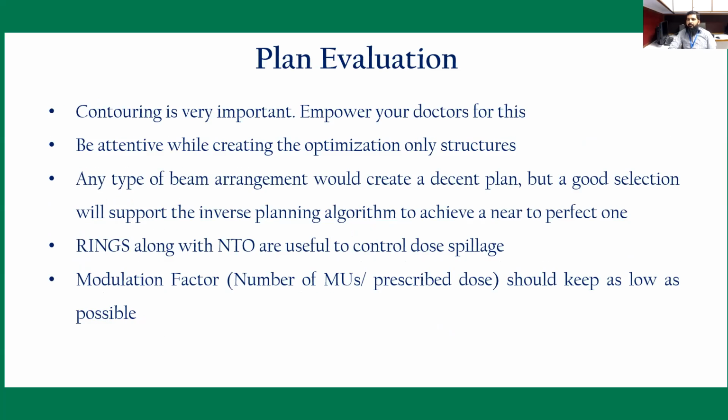Again, contouring is very important for that. For this, we have to empower your doctors regarding the contouring, so that they do their part perfectly. When you are optimizing, you are making structures, the OARs plus margins, so you have to be attentive while creating them. If you are selecting any type of arc plan, it will make a very decent plan. But for the inverse optimization algorithm, you have to make a good plan by perfect contouring and by selection of good arcs.